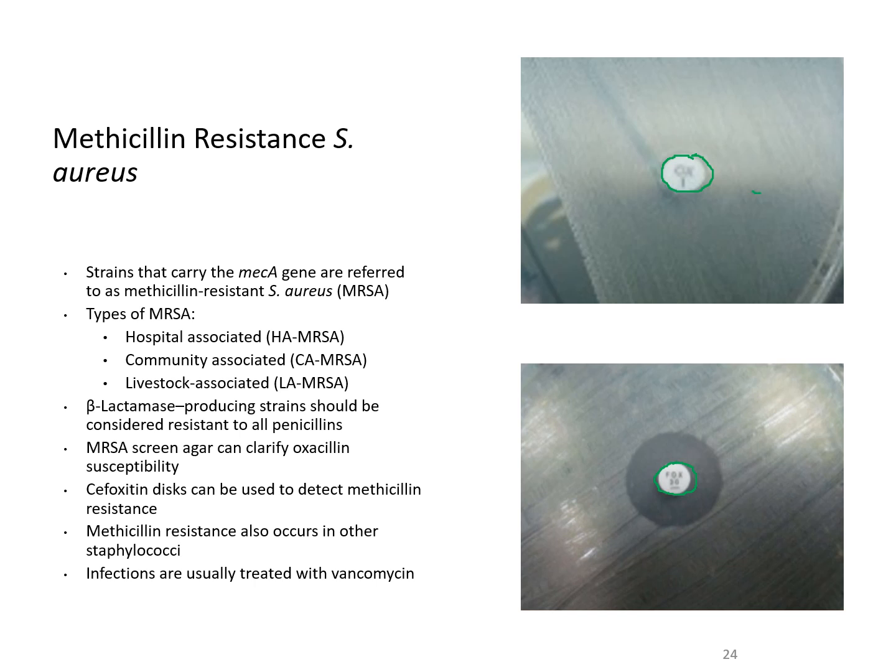an organism that is resistant, so you have growth all the way up to it, and an organism that is sensitive. And so if that organism is resistant to that particular disc, then it is considered to be resistant to methicillin. And so this would be where you would determine if this organism is MRSA, or methicillin resistant Staph aureus. And so in that case, most often this organism can be treated with vancomycin, although there are some Staph aureus species that have started to develop a resistance to vancomycin as well.